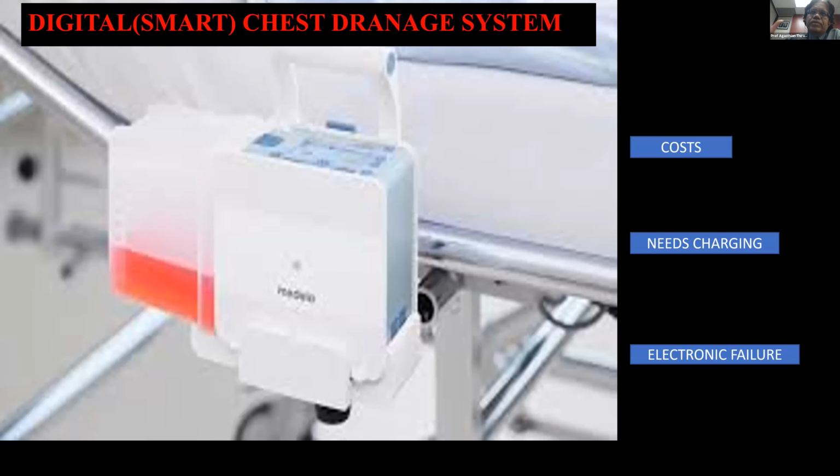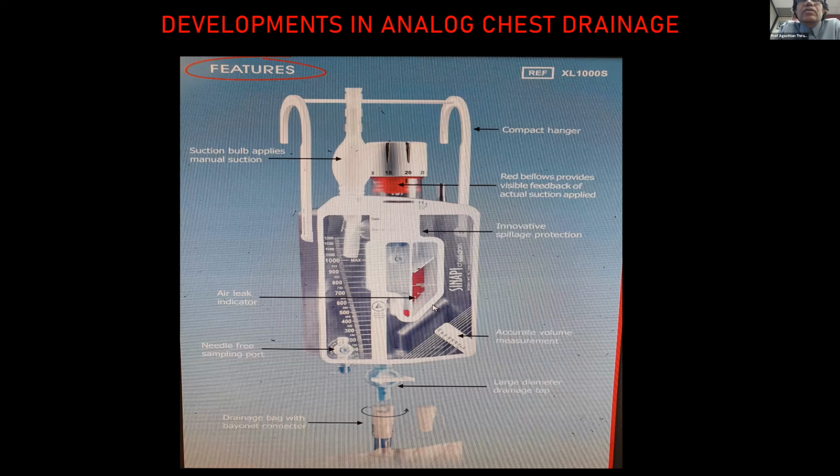Which brings us lastly to this very important topic. As there have been a lot of developments in the digital system, there have also been a lot of developments to improve the analog chest drainage system itself. And this will be addressed in the second part of this talk.